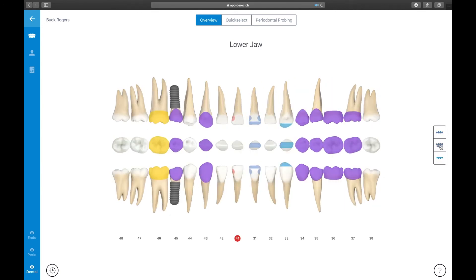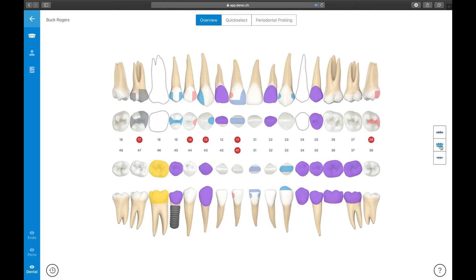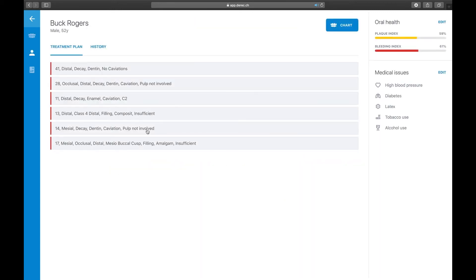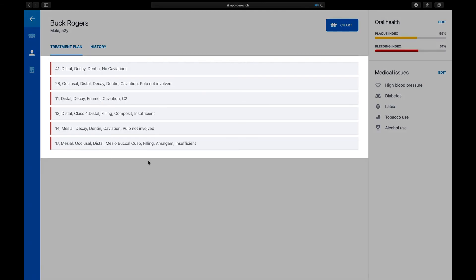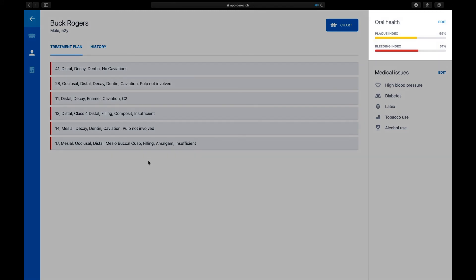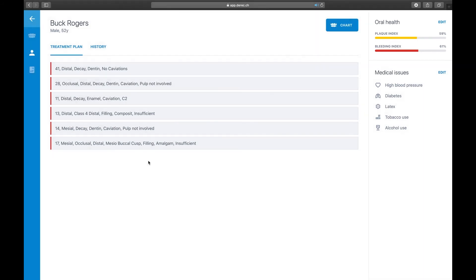We also included a legend where you can look up what means what on the chart. Let's filter the dental findings — deselect Perio and select Dental — so you can focus more on problems related to the dental hard tissue or fillings that need to be replaced. Please note that all teeth marked with a to-do item during examination are marked on the chart with a red dot on the tooth number. Let's go to the patient's overview page.